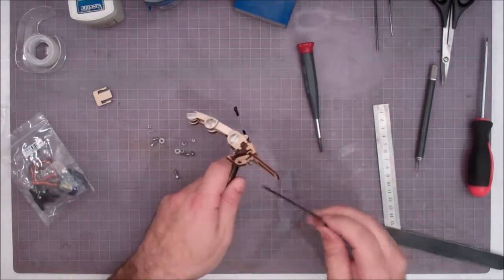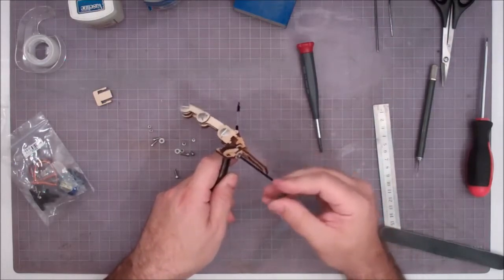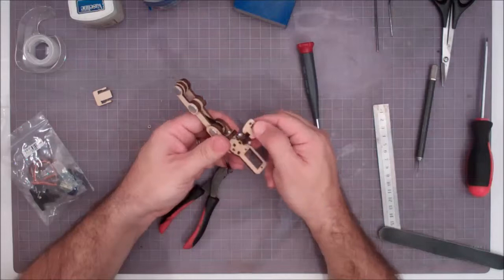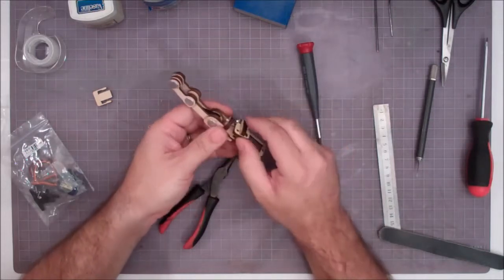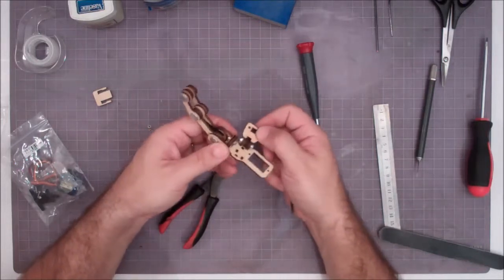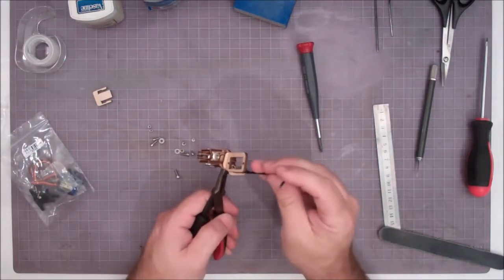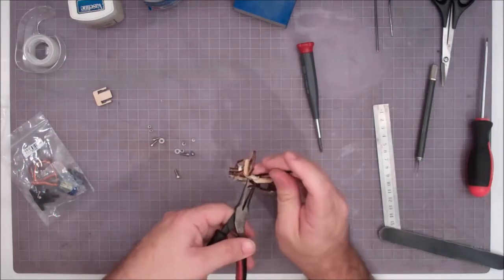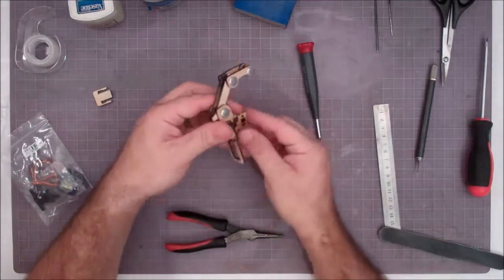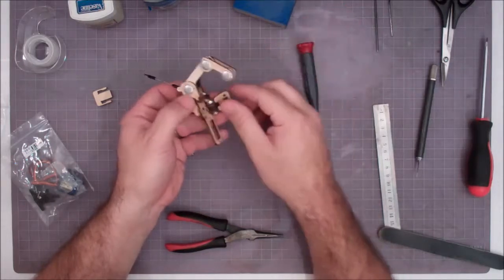Come here, you. We're just going to take that down until we just start to tighten it up. Now, I've got it, that's a pretty good tension. You can see you can rotate that thumb pad there, but it likes to stay where you want it to be. And the amount of tension you put on there is going to be completely preference. You may end up getting it to a point where you like it and locking it down, or you may leave it a little bit looser so you can adjust it on the fly. Again, it's totally personal preference, but that's what's going to allow you to roll the thumb to put the hand in a gripping style position, and we'll show that a little bit later.